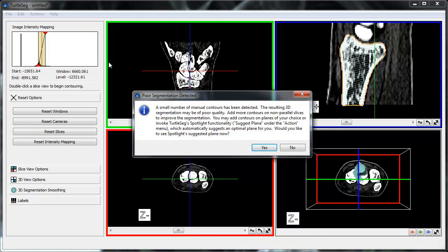The segmentation build completes successfully, but the resulting 3D segmentation is poor. One user contour is often not enough for TurtleSeg to be able to construct a high-quality 3D segmentation, and that is what this message is saying.